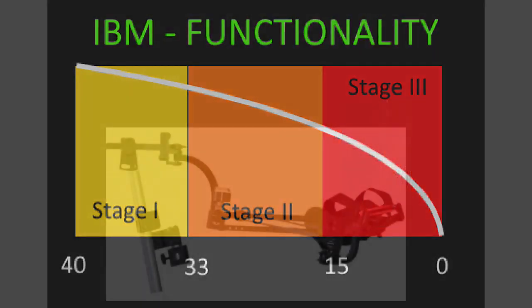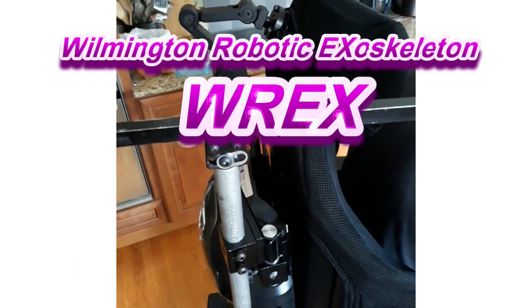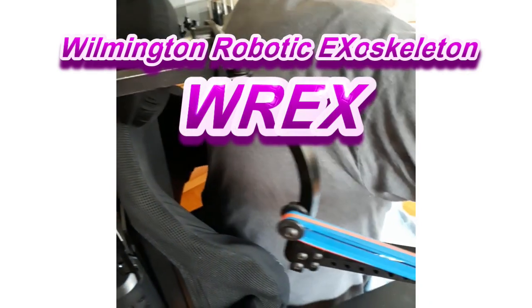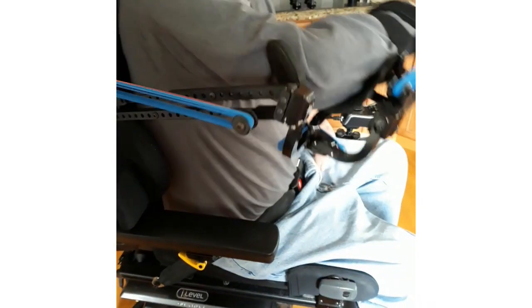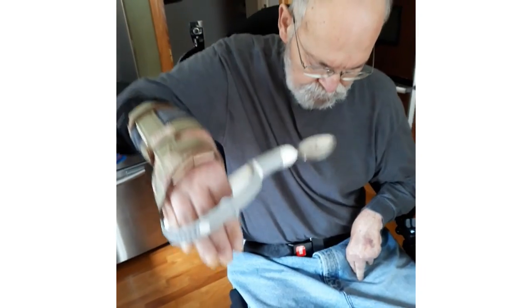I'm evaluating the ability of the Wilmington Robotic Exoskeleton, or WREX, and was hoping to improve my active range of motion and some independence that I can reassume with activities of daily living. I would determine the WREX a success if I could reach out away from my body in the forward and lateral directions and increase my reach abilities.